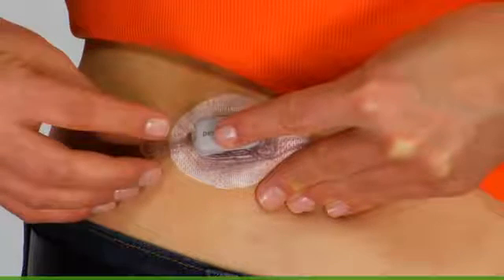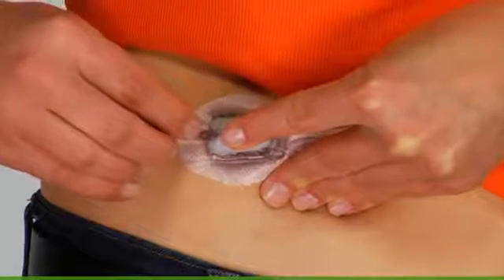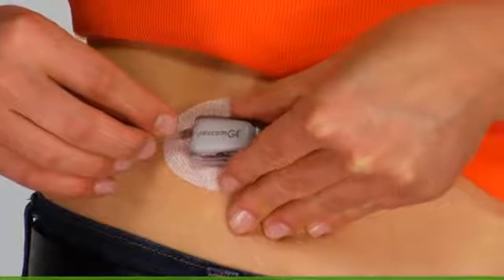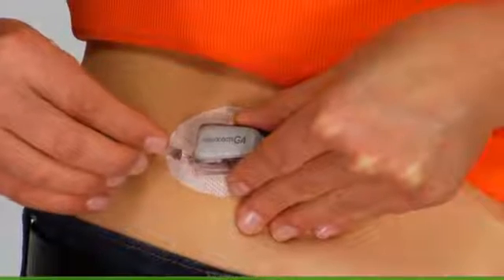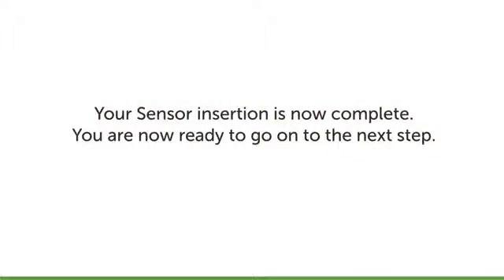With your other hand, move the transmitter latch forward until you hear two clicks. This may take some force. To remove the transmitter latch, hold the sides of the sensor pod with one hand and the transmitter latch with the other, then twist off the latch. Your sensor insertion is now complete and you are ready to go on to the next step.